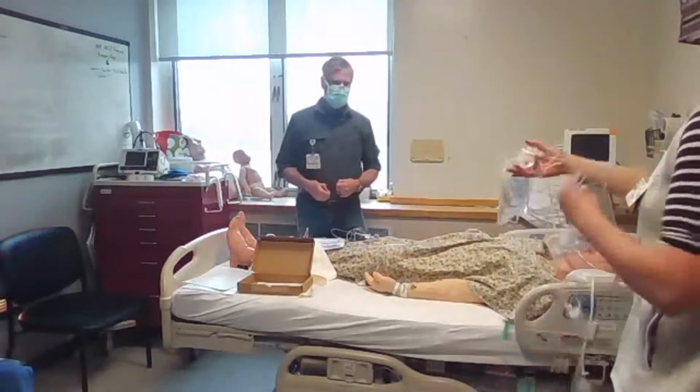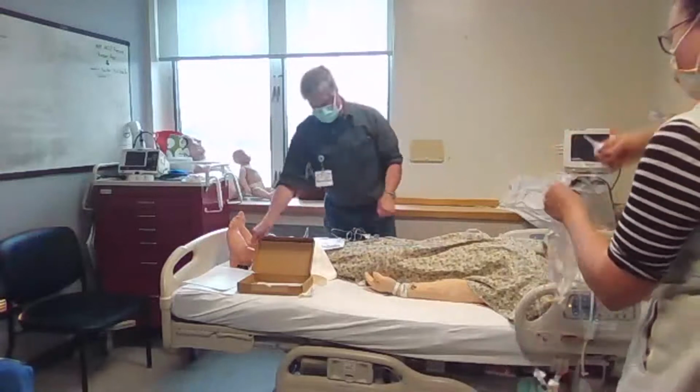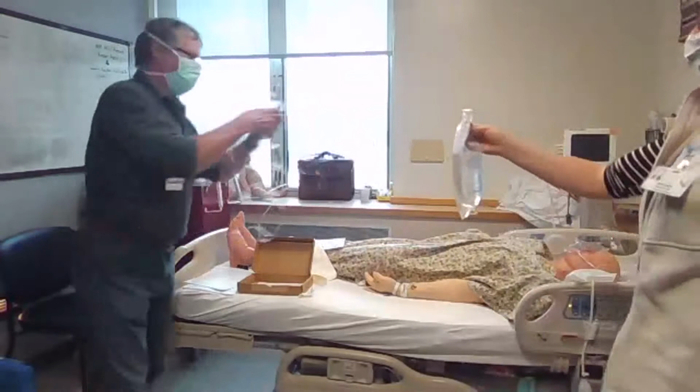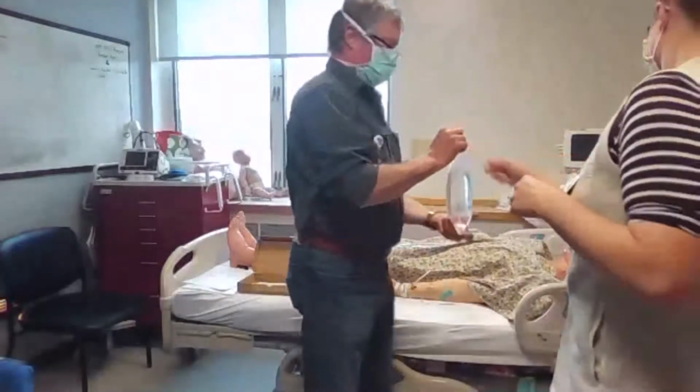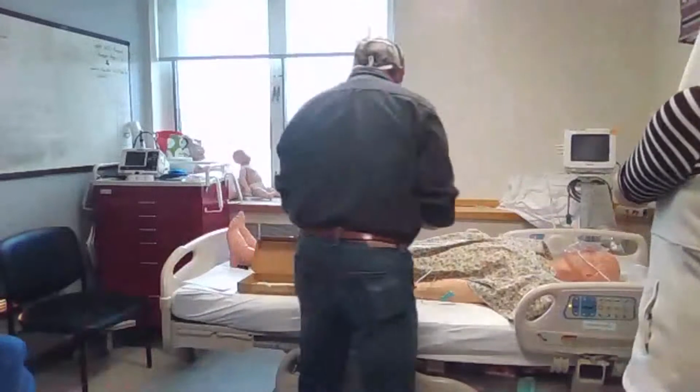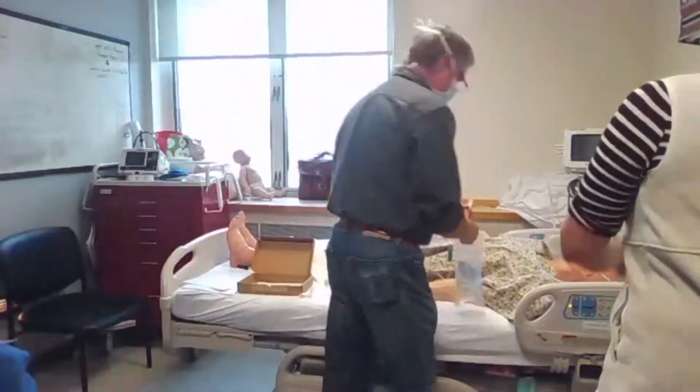We actually want to spike it, we can. Okay. I'll take my old one down. Just cut the new one. We should keep one of these in room 5. I'm gonna take this back, because I gotta practice with it for the next downtime. Here we go.